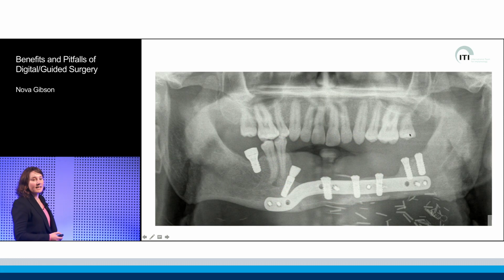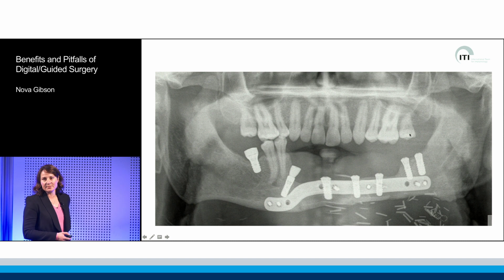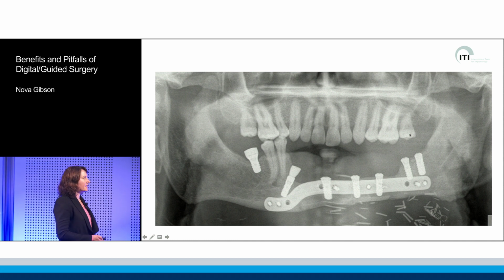But what makes his case more unique is that it is all fixed in a new part of his mandible. And that mandible is actually now a neo-mandible constructed from his fibula, one of the two bones in his lower leg.